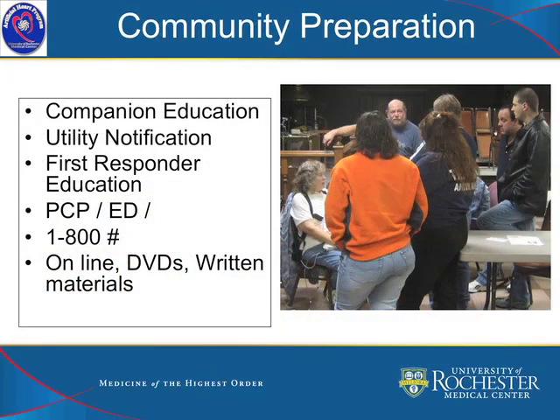Training is available from either the implanting center or the websites related to the LVAD systems, a very common one being thoratec.com or jarvikheart.com. Companion education is actually extremely intensive, and all patients are trained in their device and have families or friends who are trained and able to resource and operate the systems and respond to emergencies should they occur.